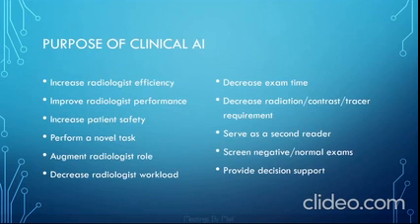AI in radiology is an extremely multifaceted tool, with applications throughout the radiologist workflow, relating both to interpretive and non-interpretive processes. This can affect everything from image processing to diagnostic support to patient safety. When we think about the three main purposes of clinical AI more broadly, a clinical AI application should serve to increase efficiency, improve accuracy, or improve patient care. An application that can address all three would be highly valuable to clinical practice, but an application must address at least one to really be worth investing in.